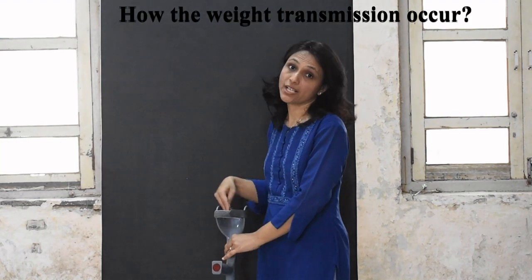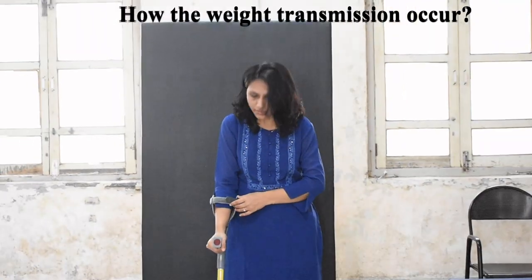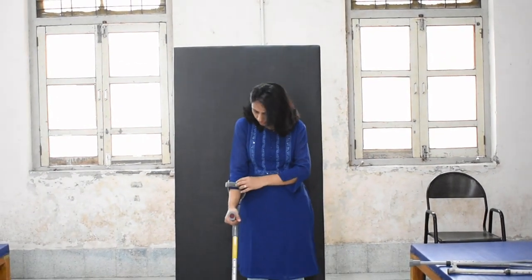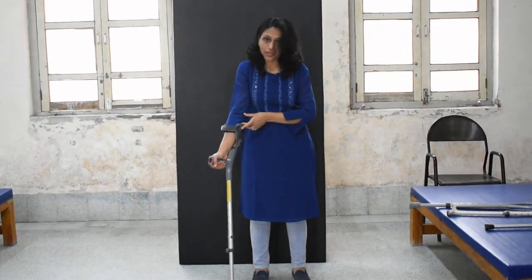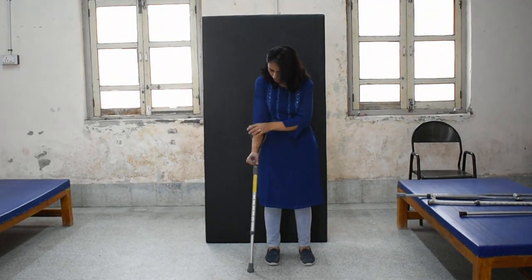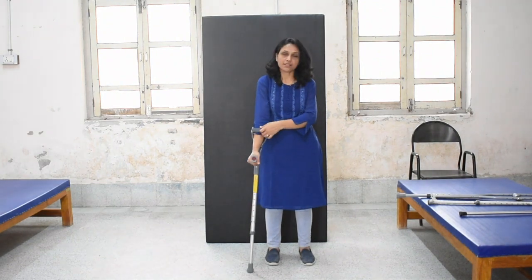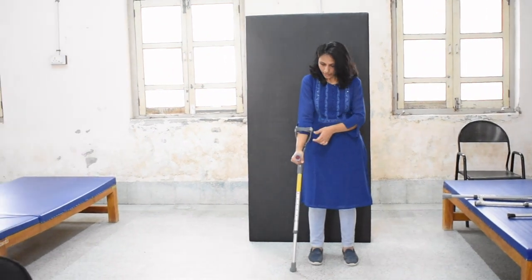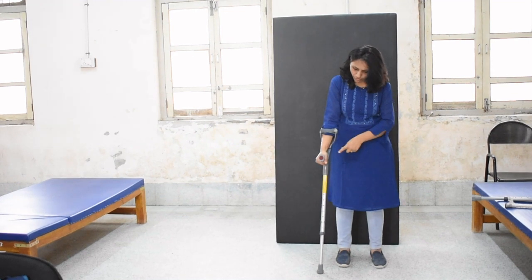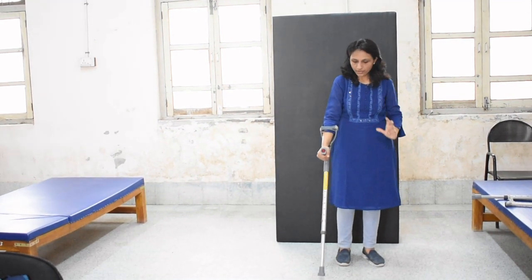Now, how does weight transmission occur? How are you going to use this elbow crutch? You are going to attach this at the upper part of the forearm. There is a strap given along with the forearm cuff, which you are going to tie according to the size of the forearm. Then you are going to hold the hand piece.